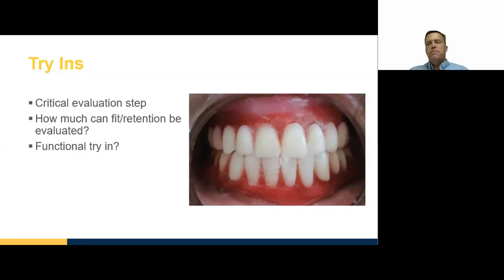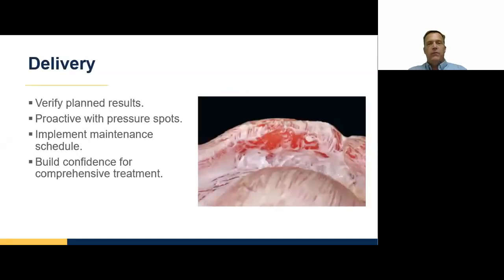And then we want to talk about, every once in a while, we'll talk about this with digital dentures. It's possible to get a printed try-in. And with those, you can actually send the person home with it and do a little bit of a test drive. It won't have pink on it, so it doesn't look as pretty and it's not as sturdy as the final denture, but it gives the person an opportunity to really try it out.